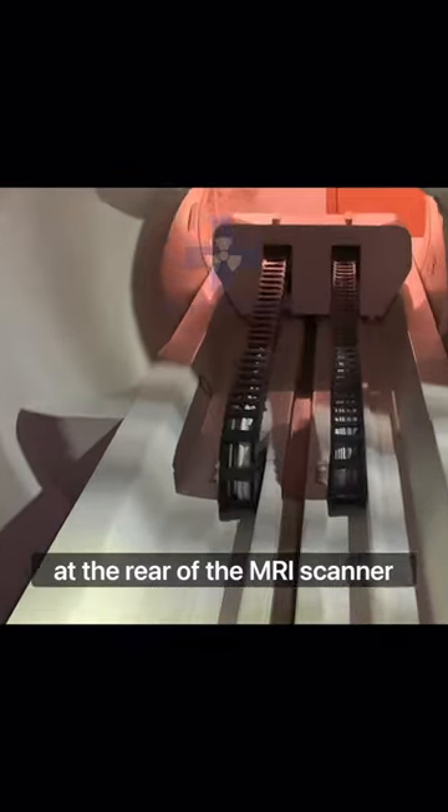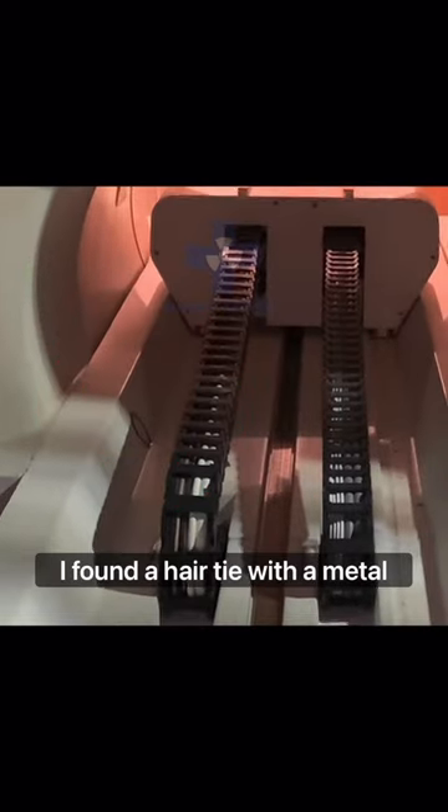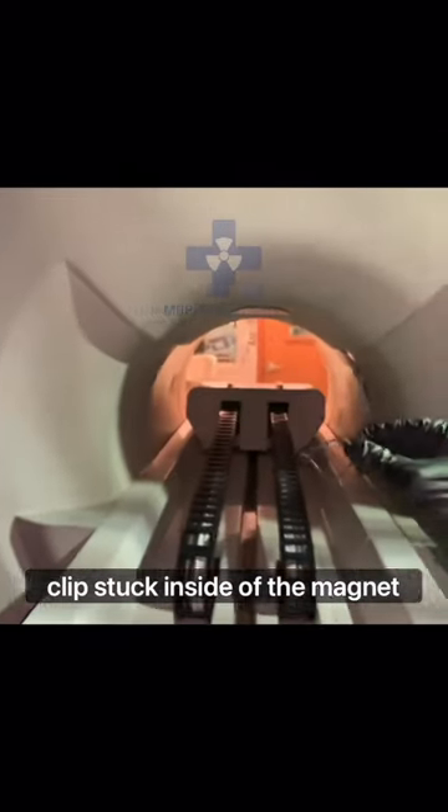During my initial inspection at the rear of the MRI scanner, I found a hair tie with a metal clip stuck inside of the magnet.